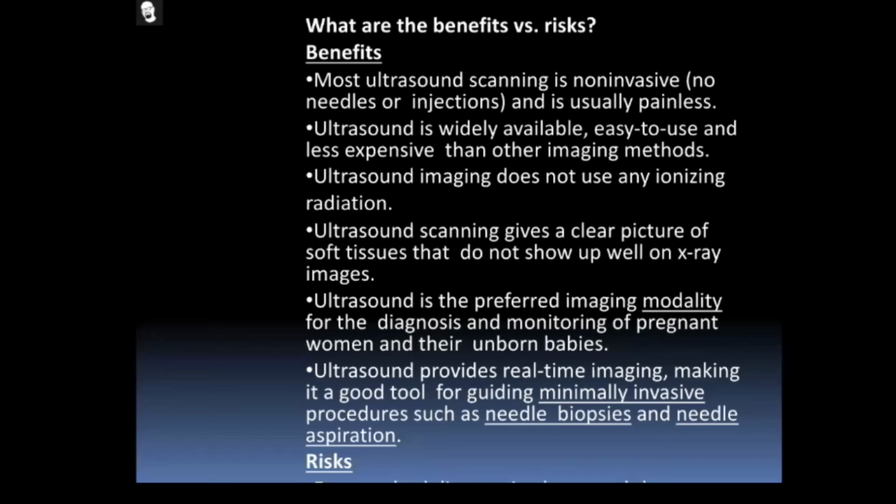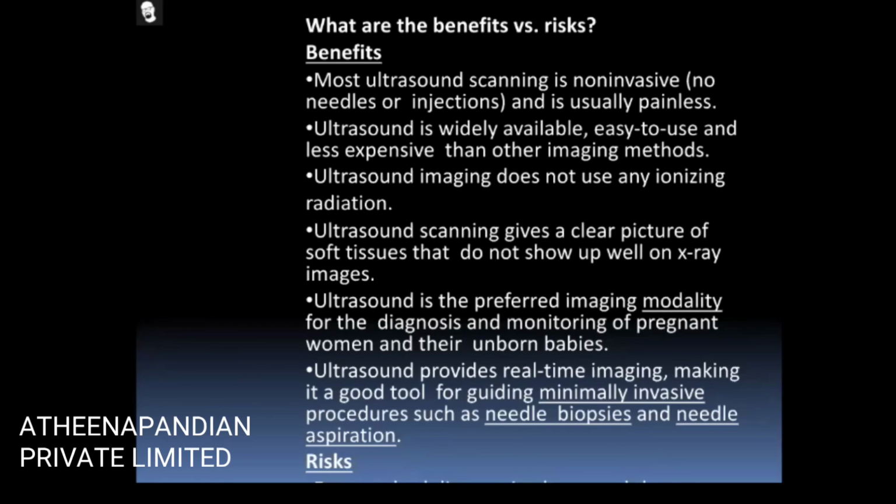So, coming to the point of the class: what are the benefits you can get using this ultrasound? Most ultrasound scanning is non-invasive. Of course, not only most, but 90% of ultrasound is non-invasive. There are no needles or injections we are supposed to use, as with an MRI scan or a CT. In a CT we are injecting some tracer, right? That is what I am pointing out. Here there is no need of any injections or tracers.